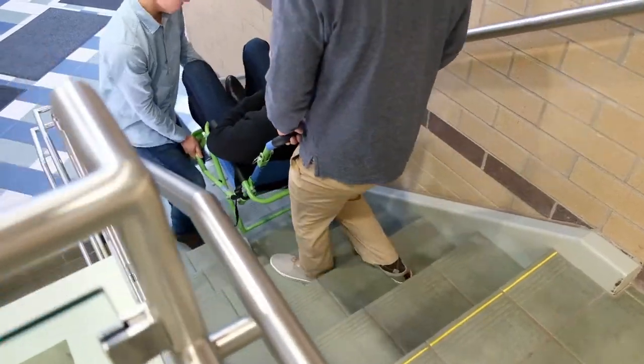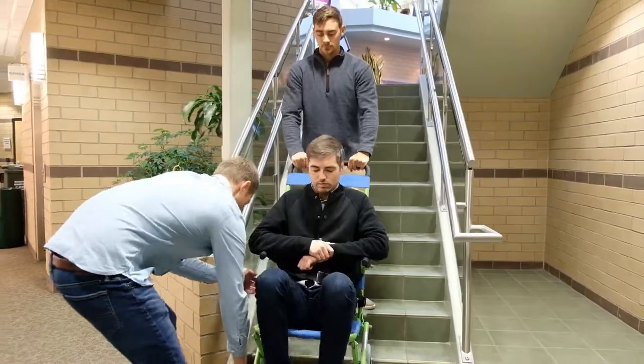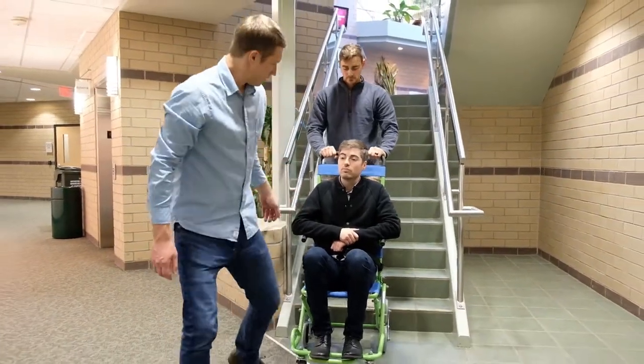Once on the stair landing, lower the chair into a static position and prepare for the next flight of stairs. When you get to the ground floor, maneuver to the final exit.